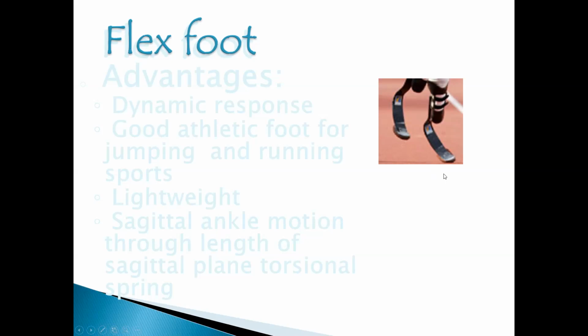Brant, who you'll meet in a couple weeks, likes to tell the story that when he was being interviewed, he couldn't stay still, because these legs kind of look like, I think, a goat's hooves, or maybe a horse's. They look like hooves anyway. They don't have very much of a weight-bearing surface. So they're great for running. They have a lot of potential for bending and energy return, but they're really bad for standing. If you're just trying to stand, they've got no heel, so you'll bend backwards. So Brant likes to tell the story that if you ever see him interviewed, he has to bounce around, he can't stay still.